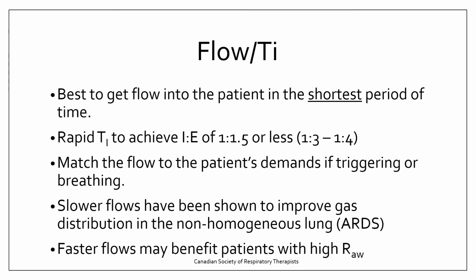You should note that you may have to match the flow demands of the patient if they're triggering or breathing on their own or assisting the breathing. So if a patient looks like they're flow hungry, then we may have to increase the amount of flow that we're giving the patient because we don't want them to work harder.